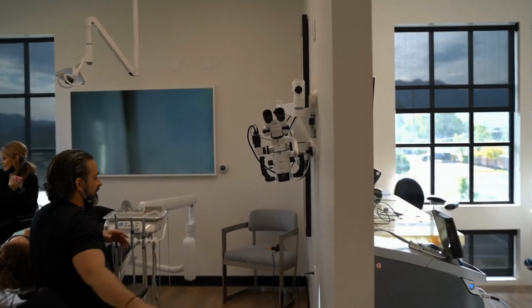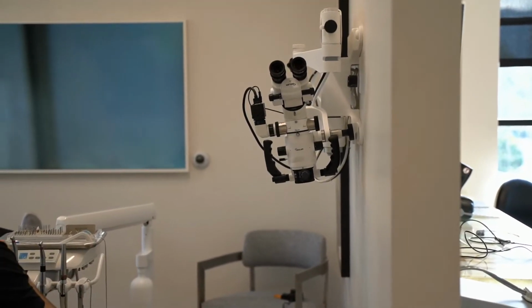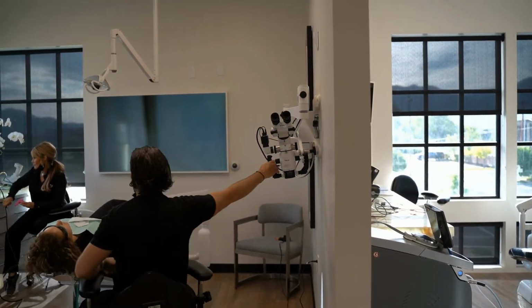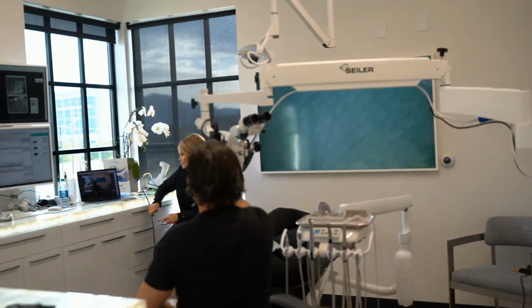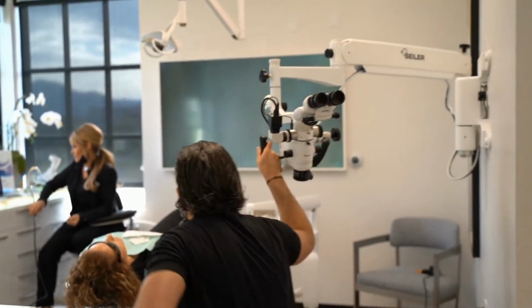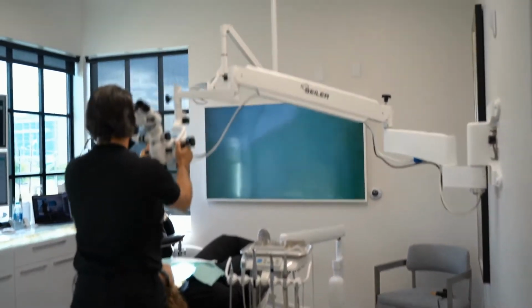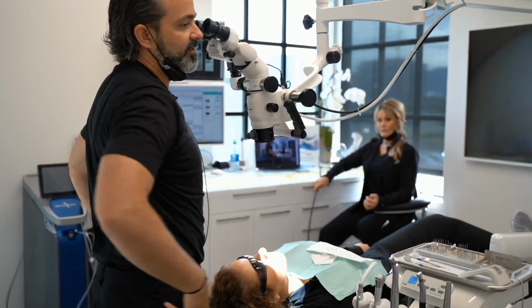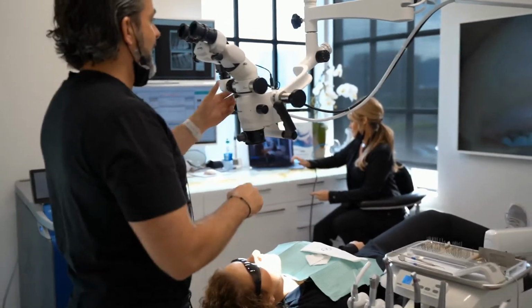There's a nice natural space here where the patient's chair or the companion chair is, and it just tucks in, and then it's very naturally easy for me to reach and bring over to my patient in a seated position. And if I'm doing a quick consult and I want to stand up and bring it over, that boom in that position is very easy for me to use as far as standing dentistry or standing surgery is concerned. So they had me at that point.